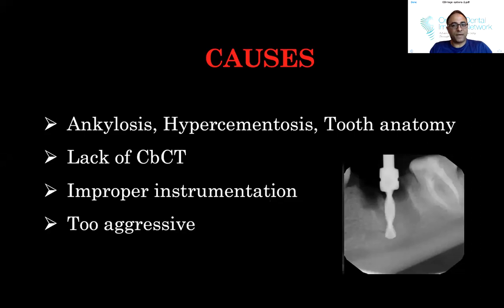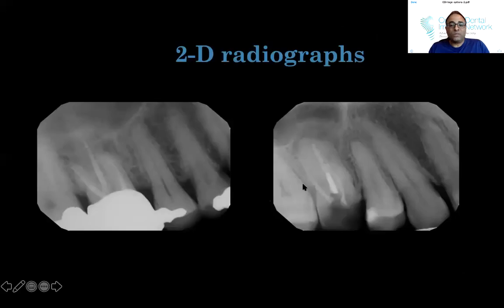I'm going to talk a bit about that as well when we get to lack of stability. So remember to assess the case and realize that these roots can curve, and if they can go undermine bone and still have an issue.